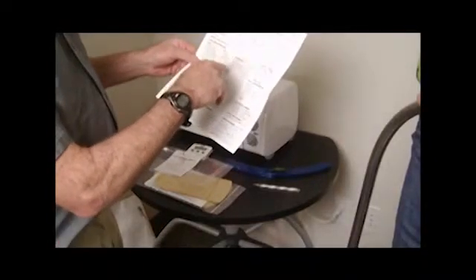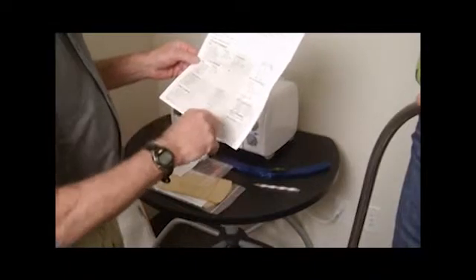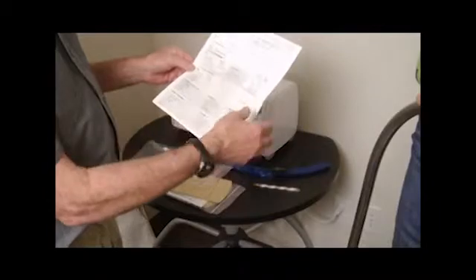You're going to select at this time the different shell, whether there's arch fill or whether it's a nylon shell with a heel post or no heel post. The top cover material you want us to use, and any other modifications like a spur cutout, high flange, deep heel cup, or whether or not you want metatarsal pads, forefoot cushions, that sort of thing.